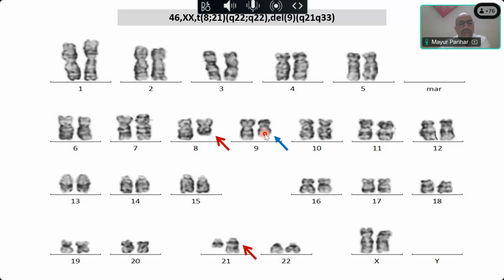So, these patients can be followed up by actually looking at the genomic abnormalities. And the response to treatment can be done by looking at the 8;21 either by FISH, or you could use molecular techniques like digital droplet PCR, or if you have a real-time PCR, to see whether the 8;21 transcript is going down.